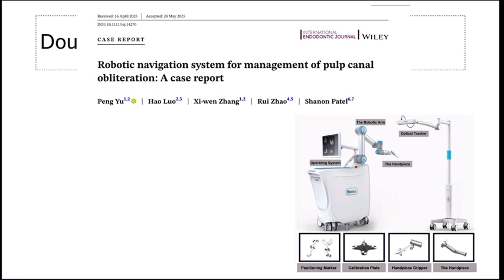More recently, implant dentistry has incorporated a robotic navigation system to enhance the digital workflow. The clinician's hands-on involvement is minimized. A pre-programmed robotic arm executes the planned procedures with high precision and reproducibility. The concept has now been translated into endodontics, as illustrated in this case report.